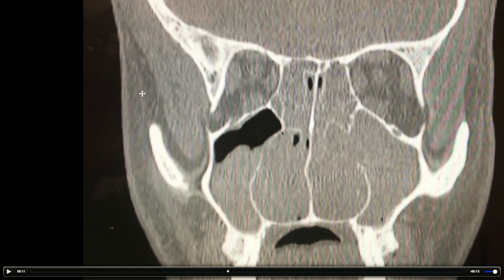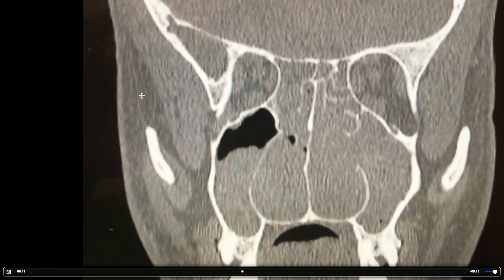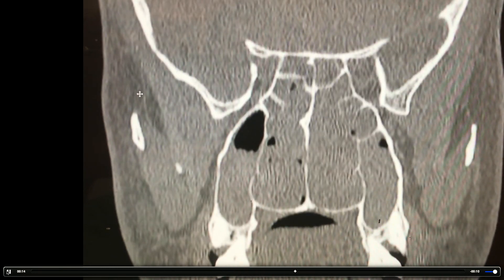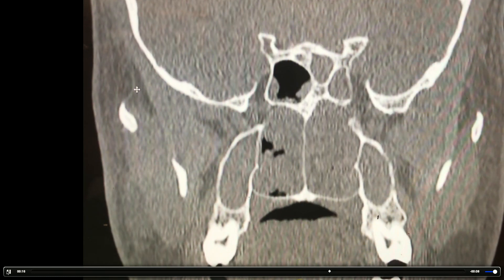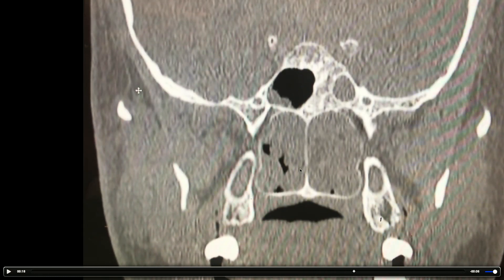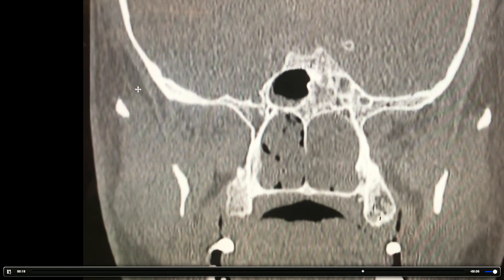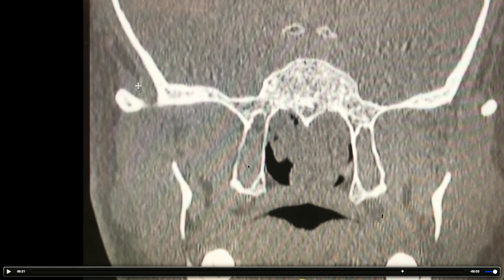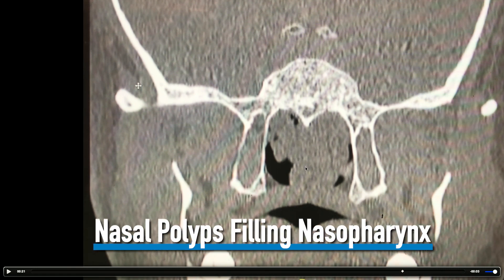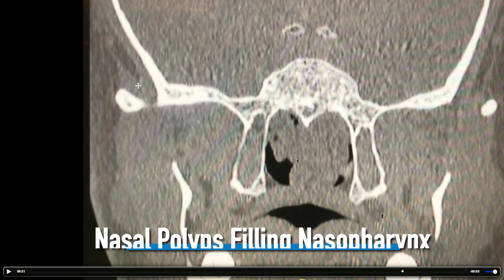Here we are in the ethmoid cavities — pretty much completely occluded. This is a significant sinus and nasal obstructed patient. And as we go all the way further back, I want you to notice something. When I took this patient to surgery, it was amazing that all the way back here in the back of the nose, it was like these polyps were hanging down like grapes. This is all nasal polyposis in the back of the nose. And when we removed all of it, the patient came back and said, 'I can breathe for the first time in my life.'